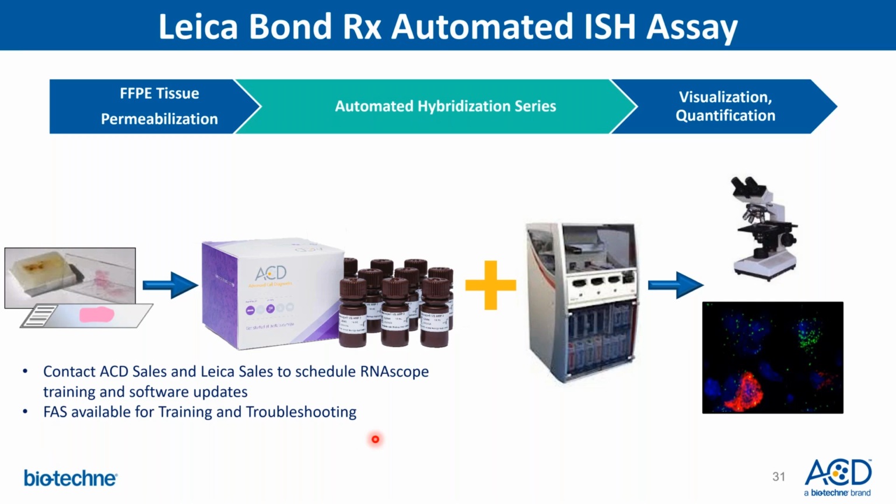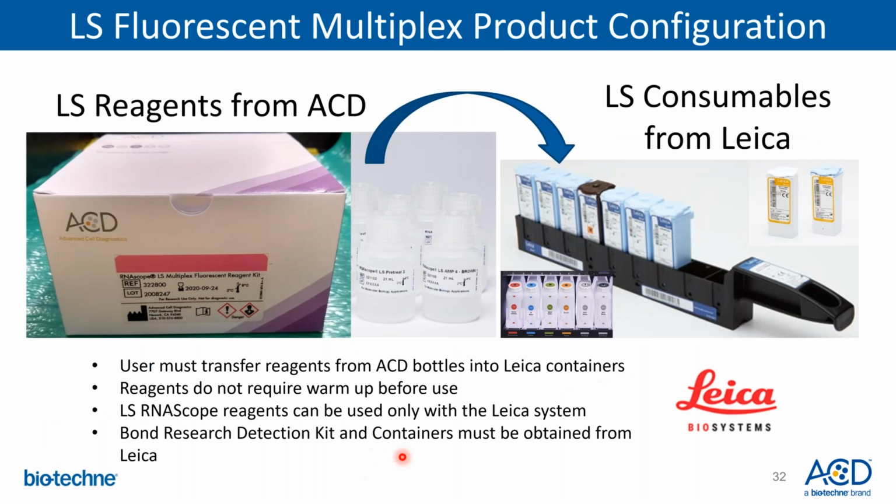Okay, with regards to the product configuration, you have the reagents that are from ACD, which would be for the LS Multiplex Fluorescent Reagent Kit.